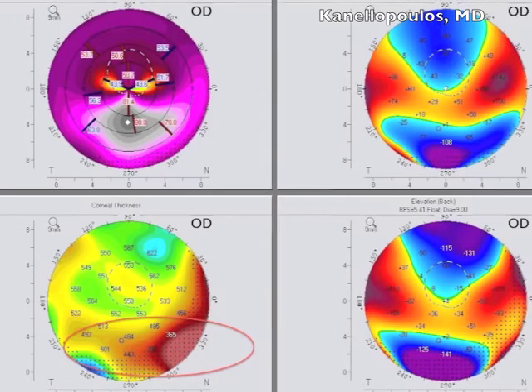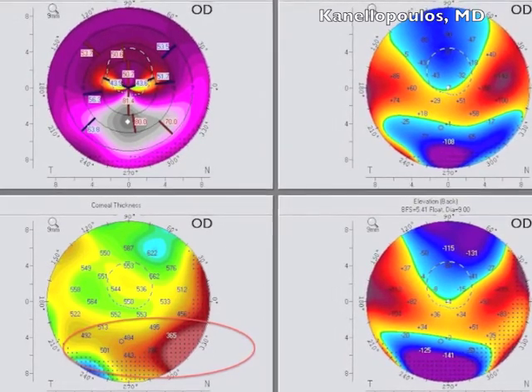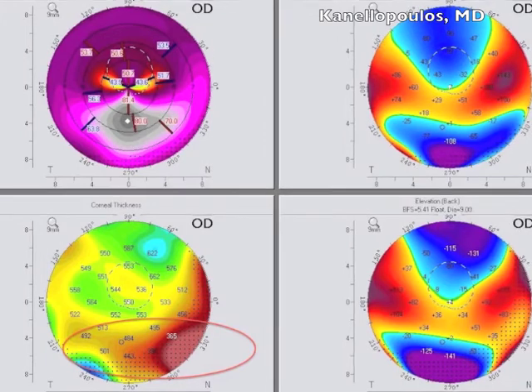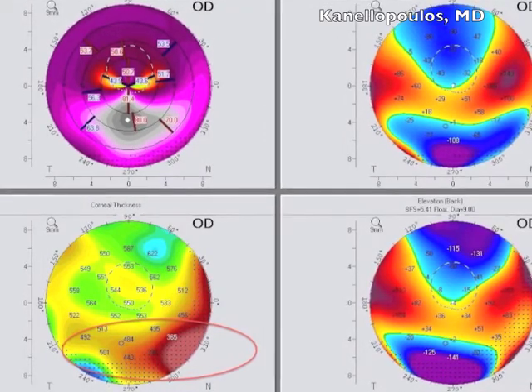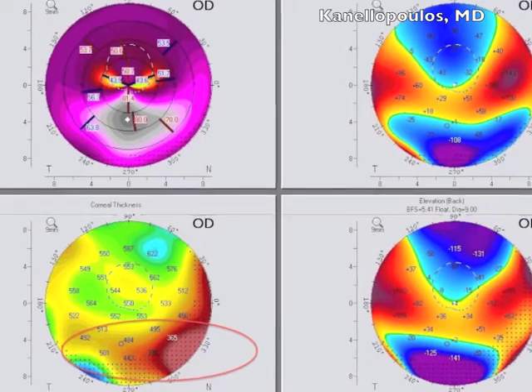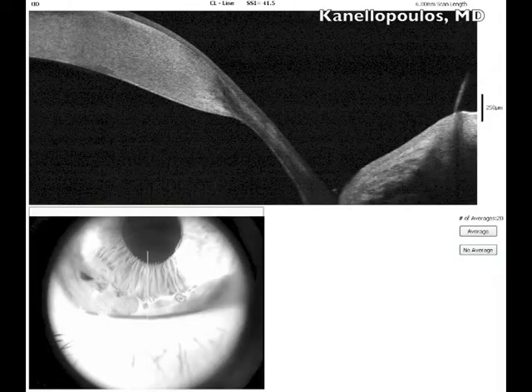So in my opinion, addressing this with refractive surgery is not the treatment of choice. We will go into the graft-host interface and try to revise it. I'm going to show you this again with another elegant way — this is the anterior segment OCT by OptiView, and you can see in this cross-section the severe thinning of the graft-host interface.